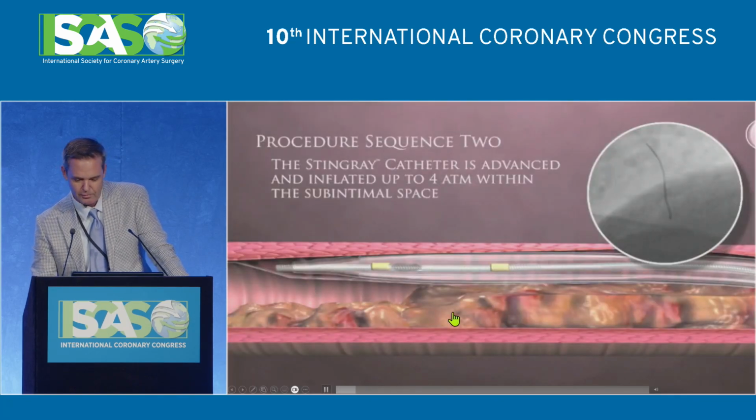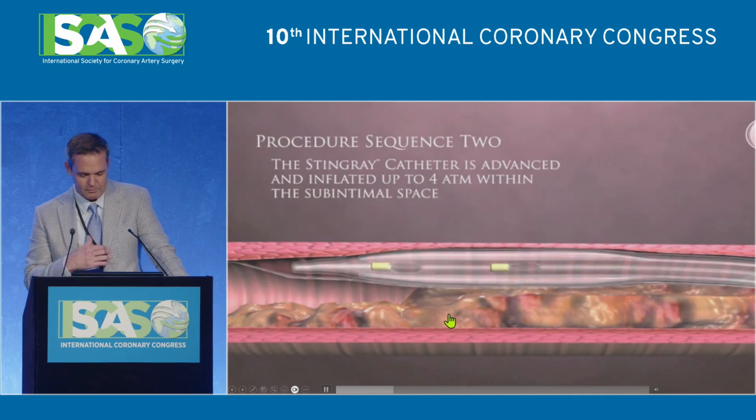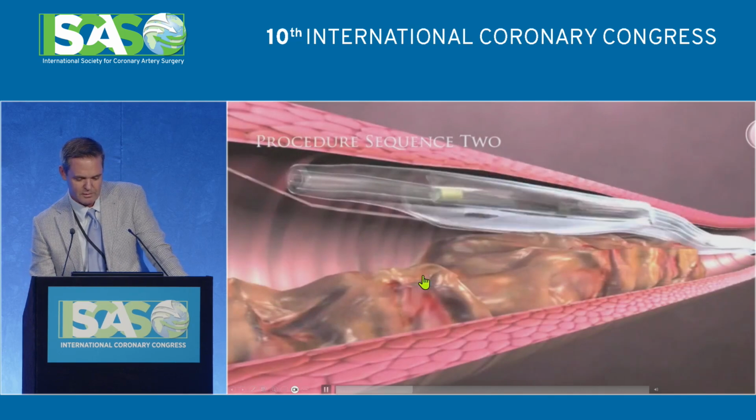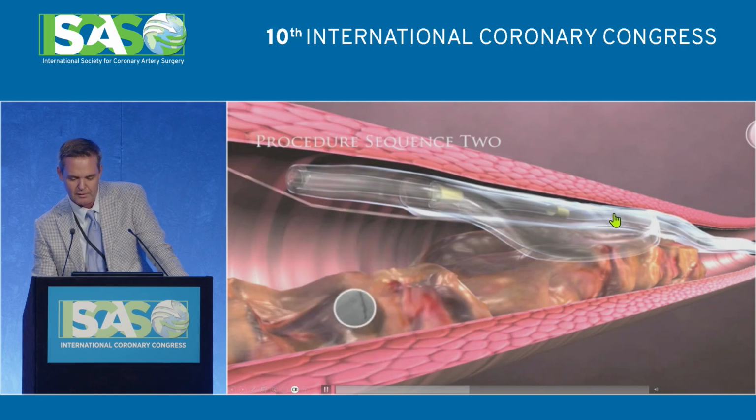One of my very close friends, Chad Kugler, invented this. I have a device we sold to Teleflex. It's going to take this off the market in a year or two. But you can see the idea is it's a self-orienting balloon. It's got two ports. It has one port that will exit and go up into the adventitia. It has another port that will come down and go back into the true lumen.